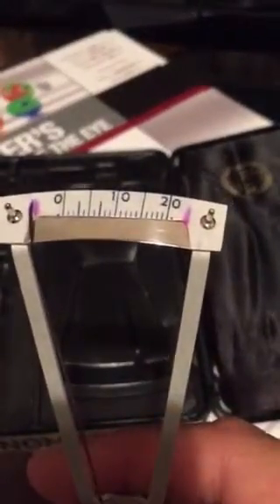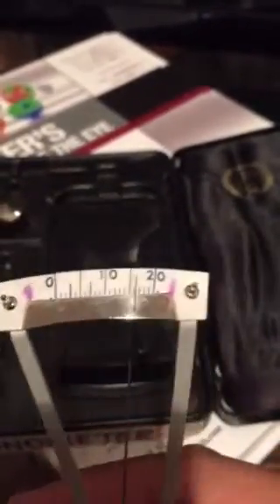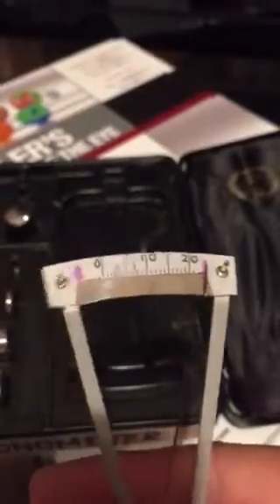The device has a grading scale between 0 and 20. Depending on where the needle points — one of these numbers — gives you your rating.